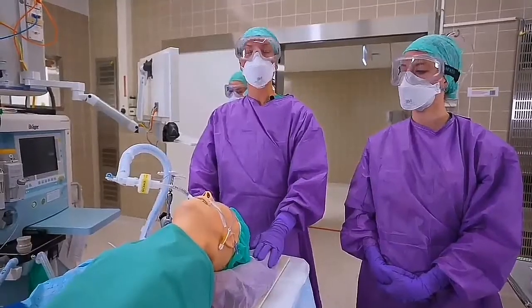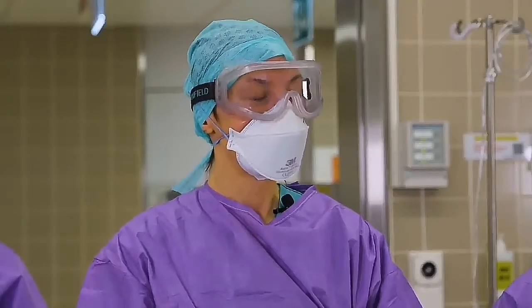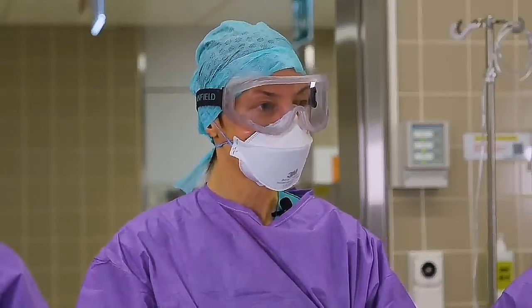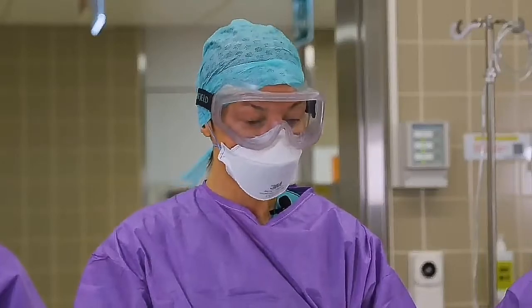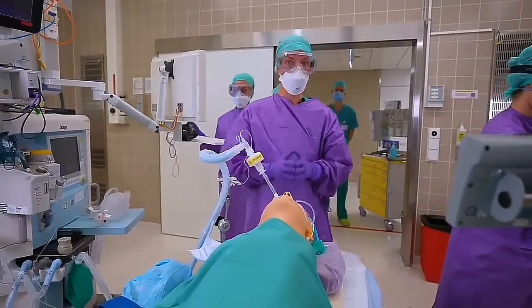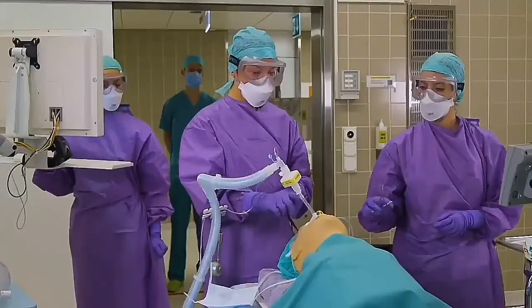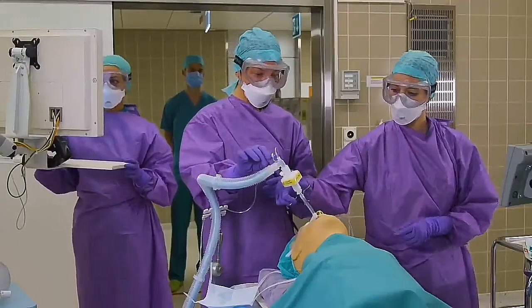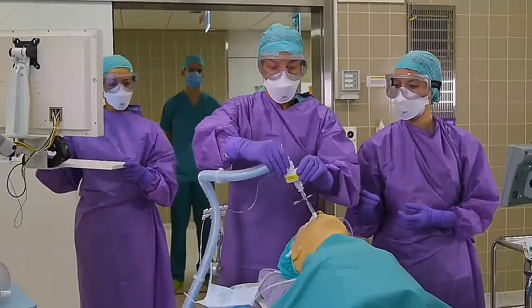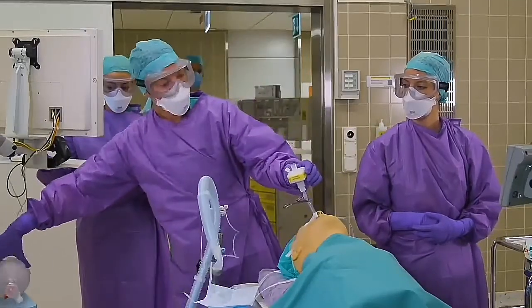Intraoperatively, we are utilizing lung protective ventilation strategies, i.e. a tidal volume of 4 to 6 cc's per kilogram ideal body weight and a PEEP. If you're transporting an intubated patient to the ICU, make sure that you clamp the endotracheal tube in inspiration before you disconnect and reconnect to your bag valve mask.